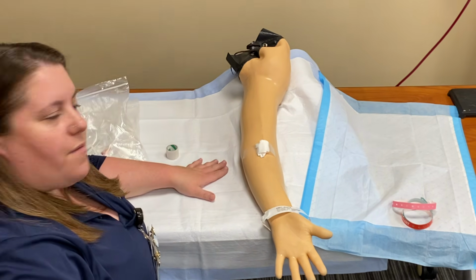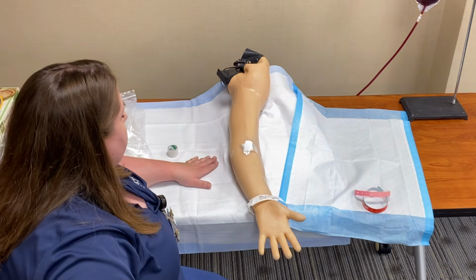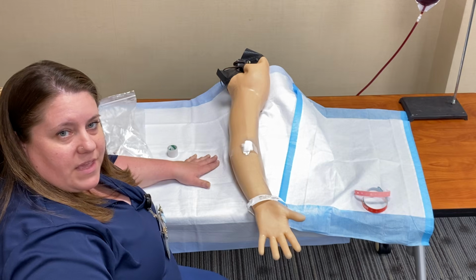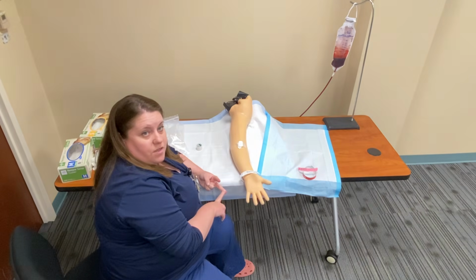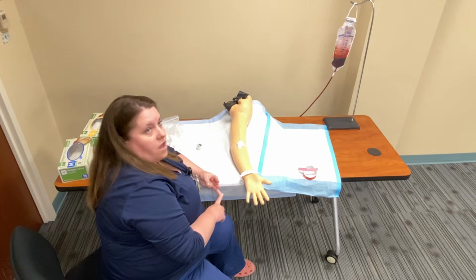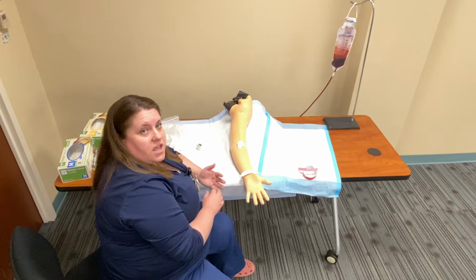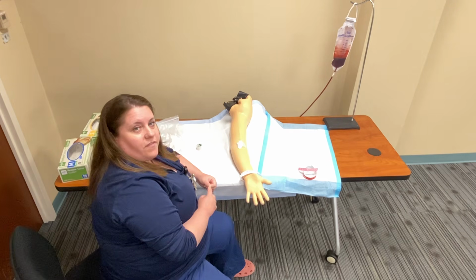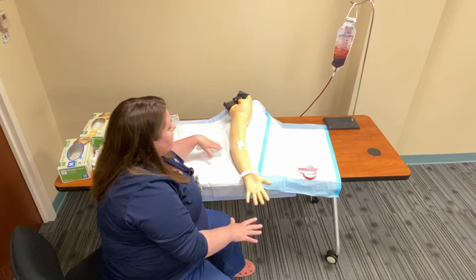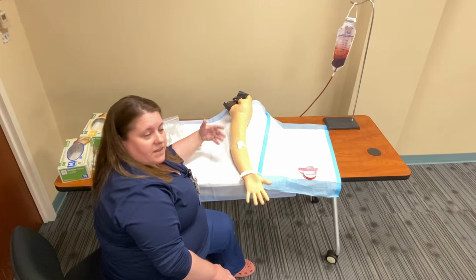I want to make sure that my patient's doing good. Ms. Gray, are you okay? We're all finished. I'm going to send your sample to the lab. I'm going to go through my P's and Q's. So ask her if she has any pain, if she needs to go to the bathroom, which is potty, is she comfortable, her position, does she have all of her possessions, does she have her phone, her glasses, anything I can get for her. I want to do prevention, make sure her bed's in the lowest position, she's got her call bell, side rails are up as appropriate, so preventing falls.